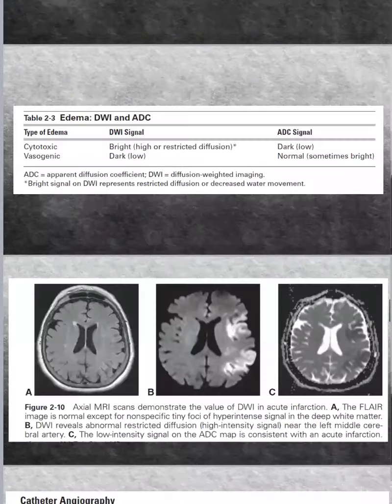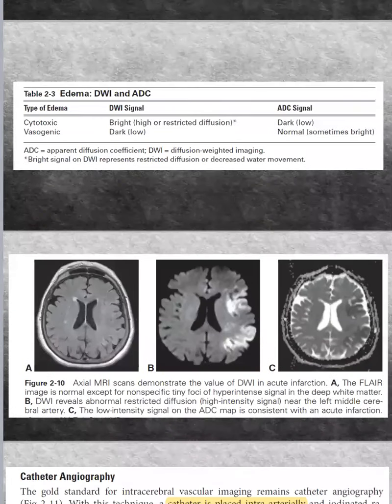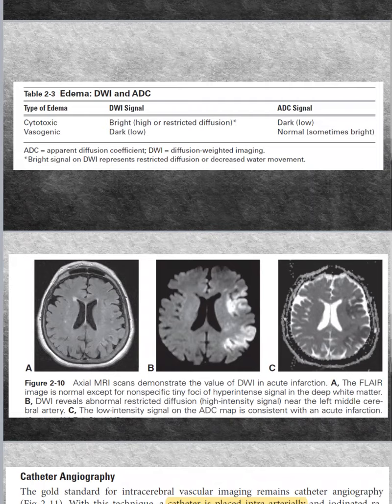The differences between cytotoxic and vasogenic edemas, I may have differences between DWI and ADC, and this is not important for us.